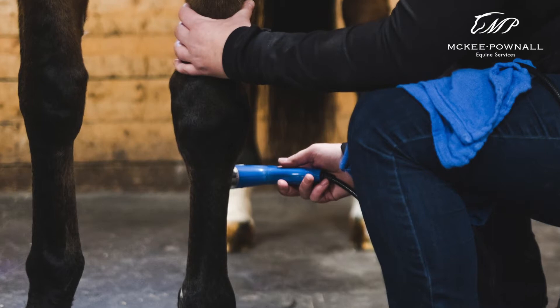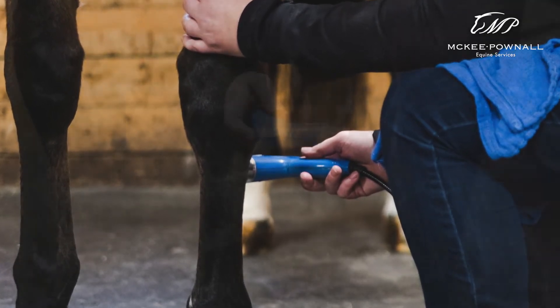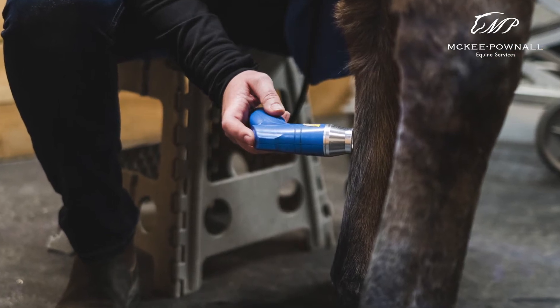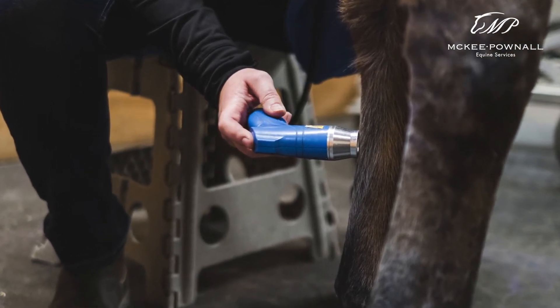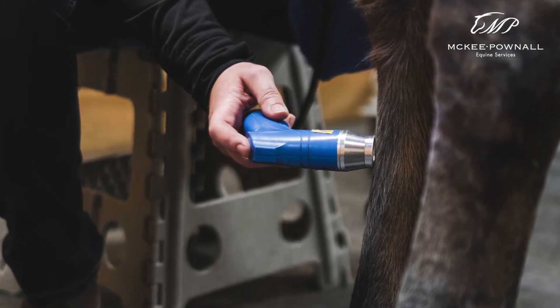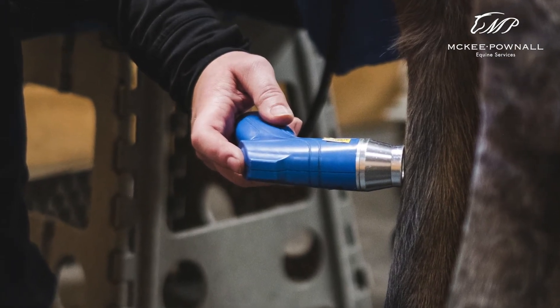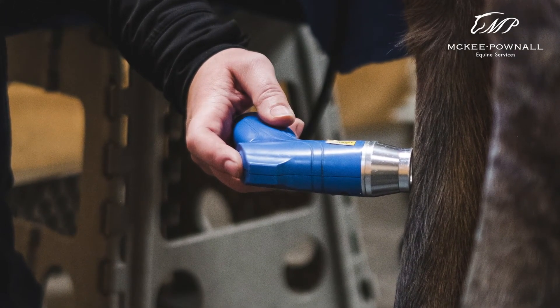It benefits your horse by repairing ligament and tendon lesions, promotes long-term healing as well as quicker recovery. When used for pre-performance, the horse would receive two to three treatments prior to a race to treat a specific area that may be showing signs of pain, discomfort, or overuse, to help reduce risk of injury, reduce inflammation, and decrease recovery time.